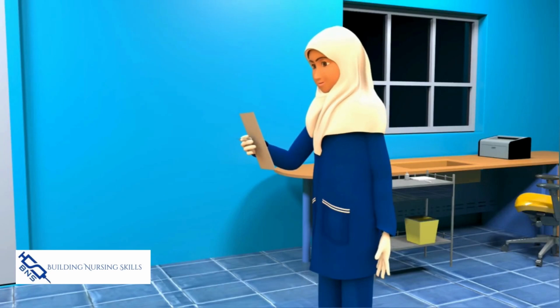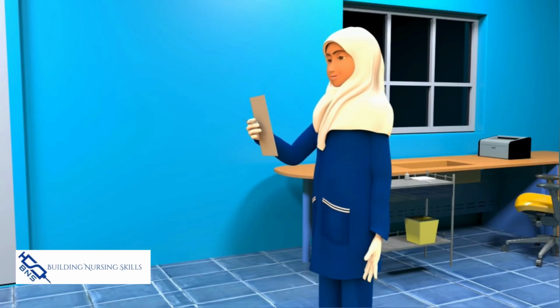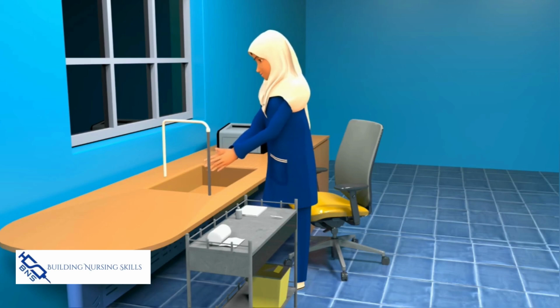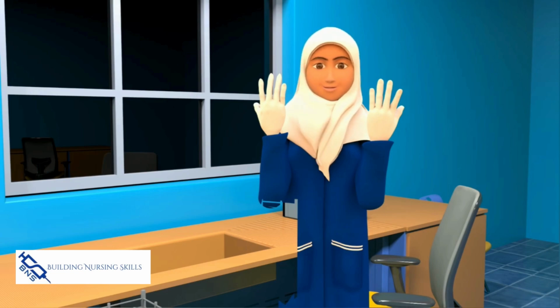Verifies the physician order for the prescribed medication. Checks the patient's medical record for an allergy or contraindication to the prescribed medication. Performs hand hygiene and dons non-sterile gloves. Selects the correct medication and compares the label to the order in the patient's medical record.